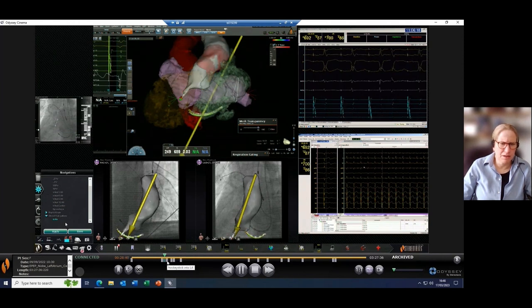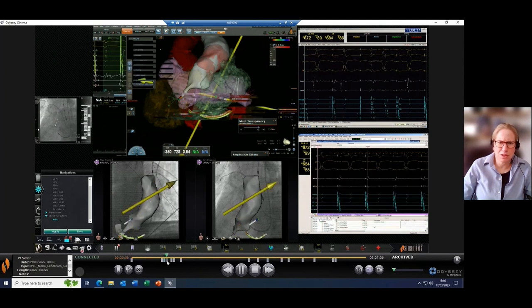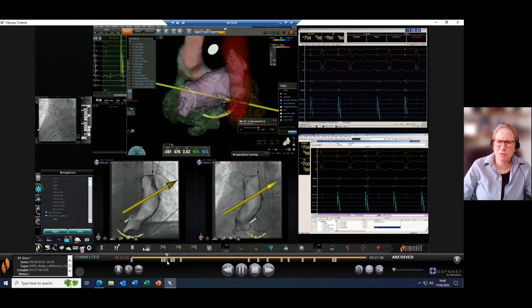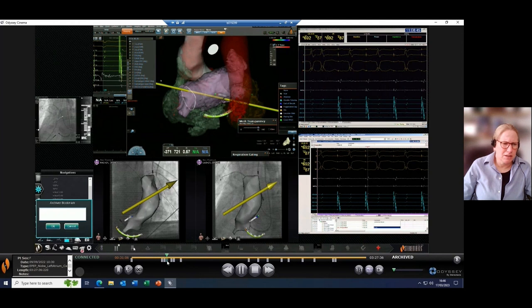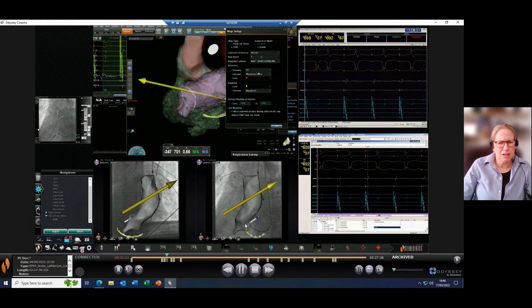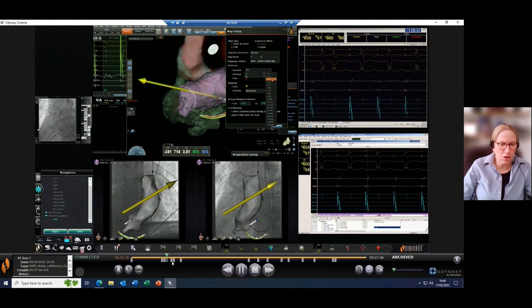Just a bit later, we'll get into the left atrium. I'm just going to jump forward so that you can see that entering the left atrium is a simple task, very easy with this retrograde approach. And again, the catheter is aligning in the magnetic field direction, as you can see here. If there's an obstacle, it's too soft to push anything away, it just won't go. So you can try all kinds of crazy moves if you need to.